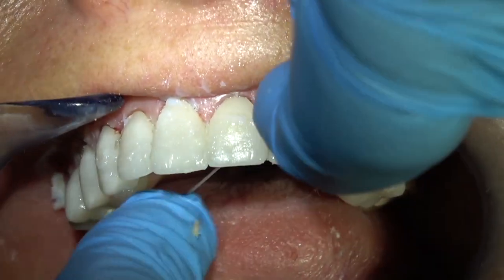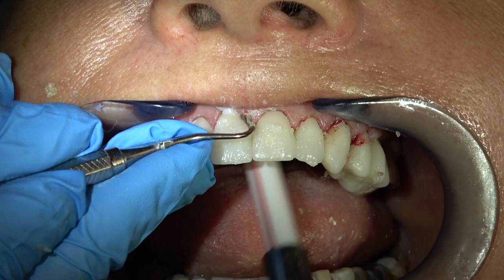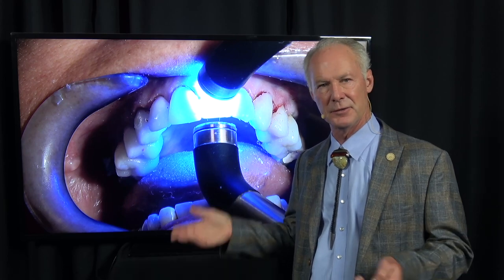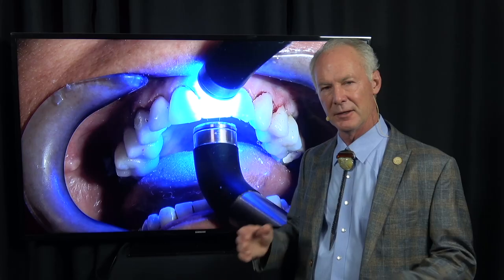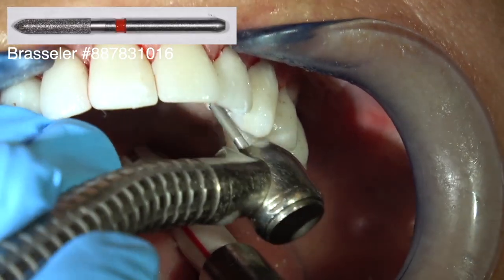If you'd wiped it off there would have been suck-back - that's a critical part of having the gingival tissue around seated veneers look like natural tissue. If you wipe it off you're going to have bacteria in that micro gap and irritated gingival tissue. If you cured more than a second, that excess luting composite is going to be too hard and you'll have to polish it off with a 12 or 30-fluted carbide bur. Then pop floss between the crowns and veneers, pulling it to the lingual. Then go back and cure each veneer - I use two curing lights, 60 seconds on each side per veneer.